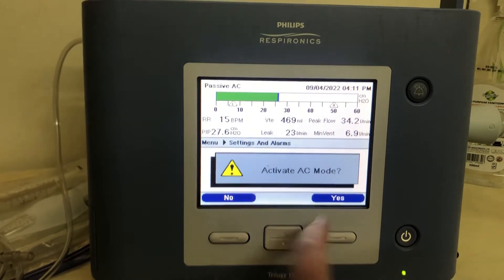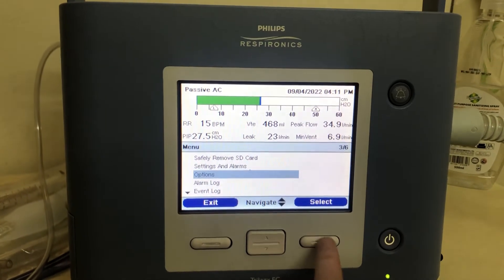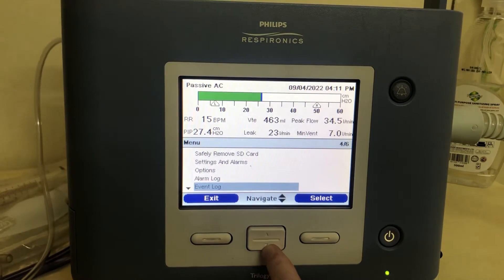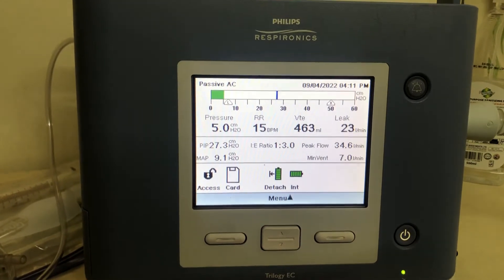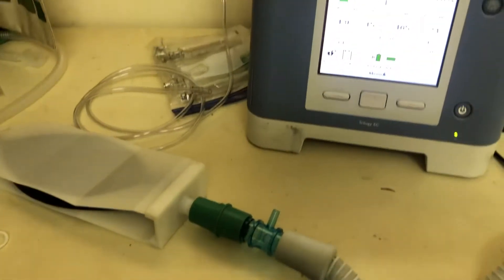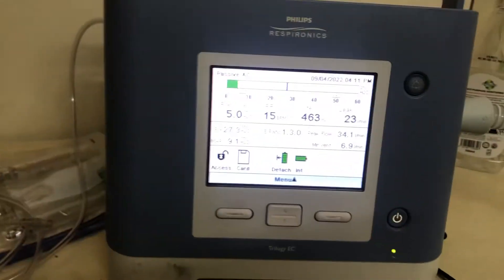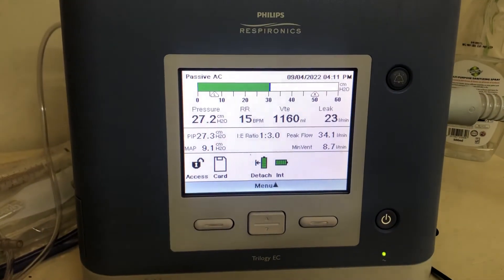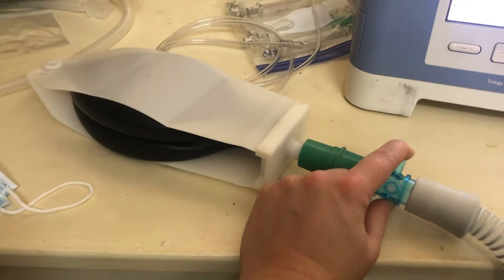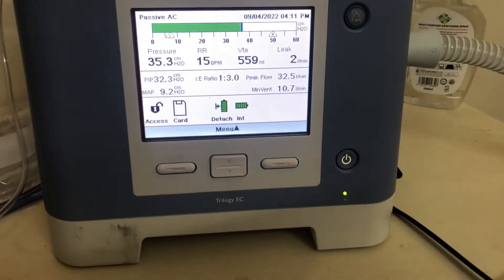Then just hit finish and activate the mode. There are some other options you can explore, but they're not necessary so don't feel you need to go through them. It's a really simple machine to use. You can see it's ventilating well now. The patient is exhaling through this port. If I accidentally close this port, the machine gets much quieter and the patient is still being ventilated, but there's nowhere for the exhaled air to go — which is dangerous for the patient.